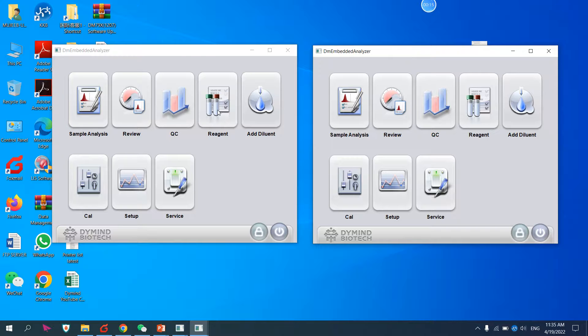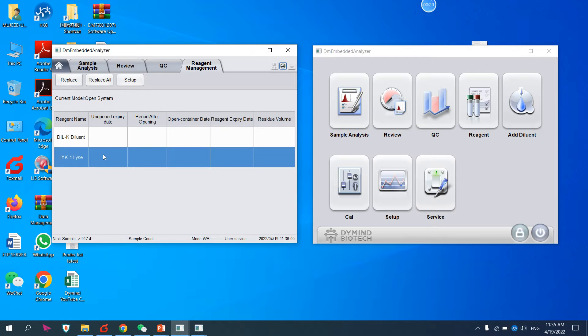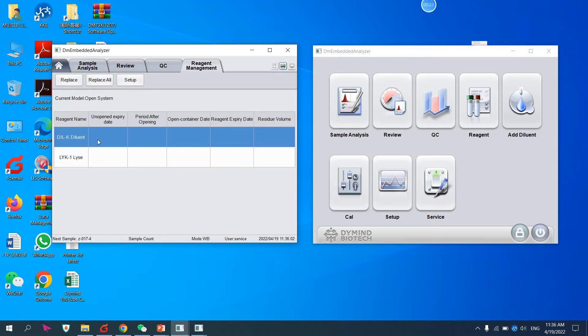This is the reagent. We come here, and here we have two reagents: diluent and lyse. Lyse 1 and this is diluent. First you have to know which one you want to replace. For example, I want to replace Lyse 1.